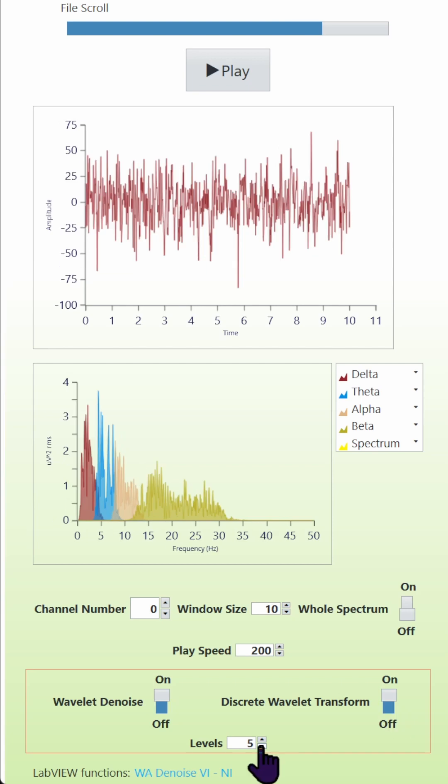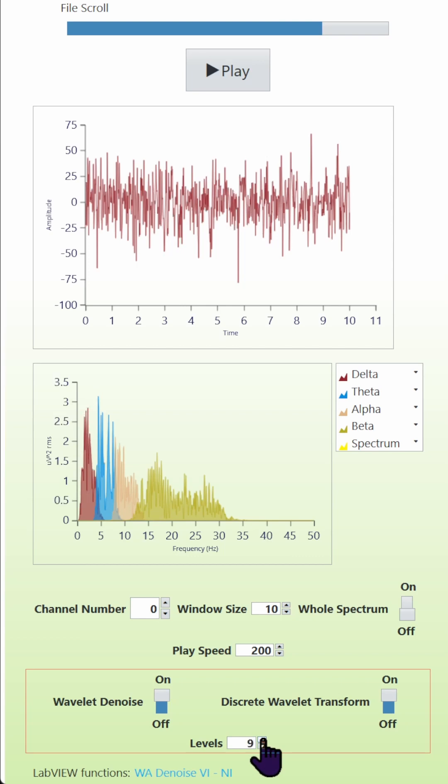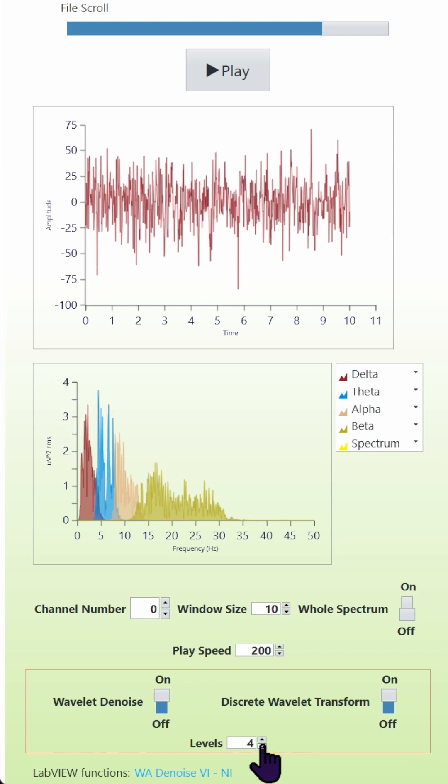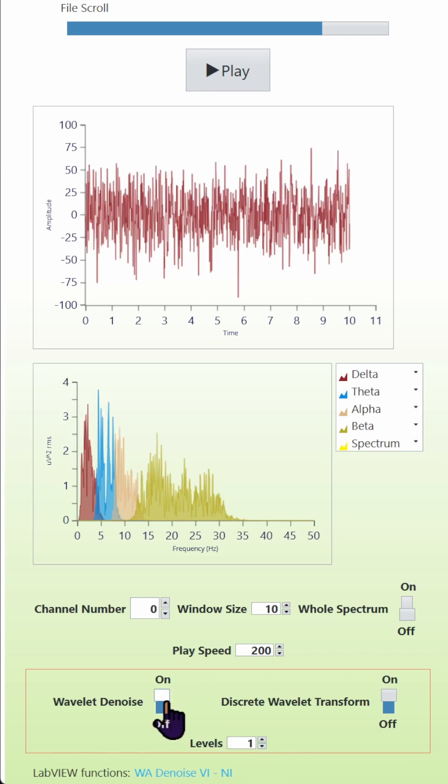Finally, this parameter at the bottom will allow you to select how aggressive the algorithm is, so it will remove more noise. Here you can see when I go from 10 down to 5, it becomes less aggressive.